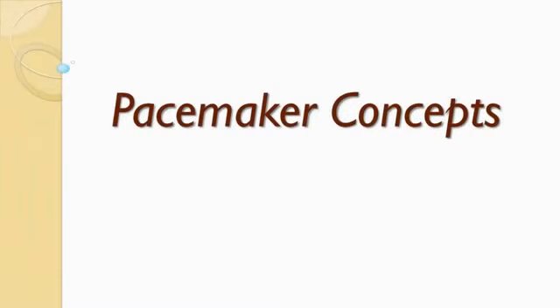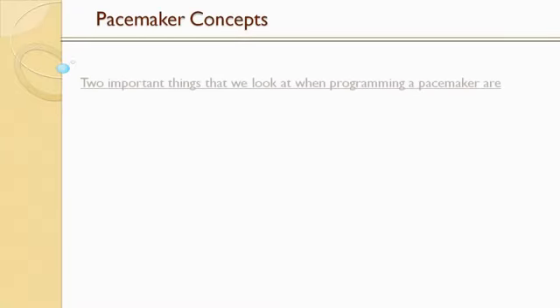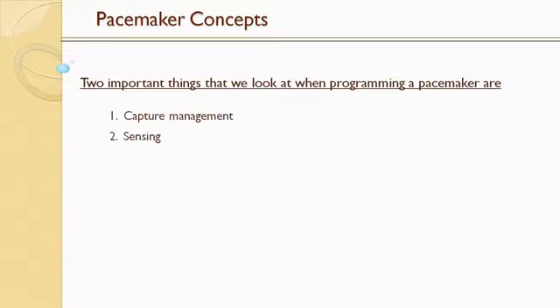Pacemaker concepts. This presentation is really about the concepts or the reasons why we program the pacemaker the way we do, for things like thresholds, outputs, and sensing. Two important things that we look at when programming the pacemaker are capture management and sensing. Whenever we check a patient, we really should measure a pacing threshold and then adjust the patient's outputs accordingly.